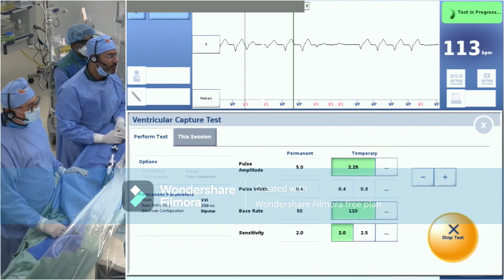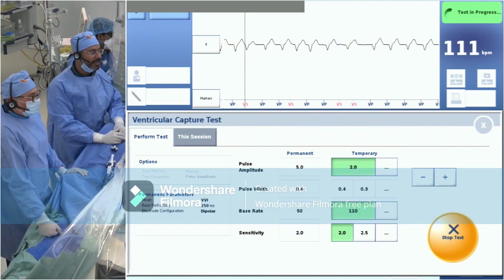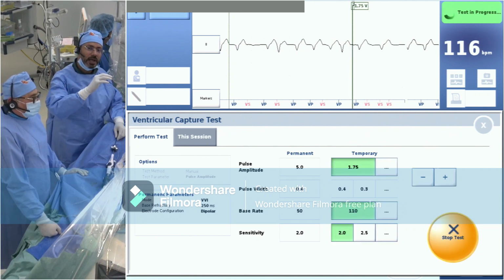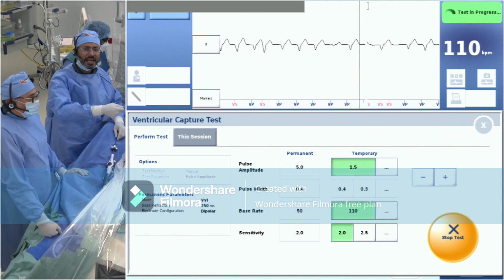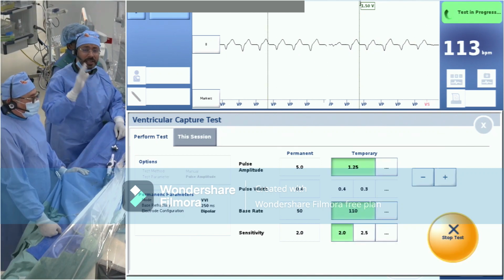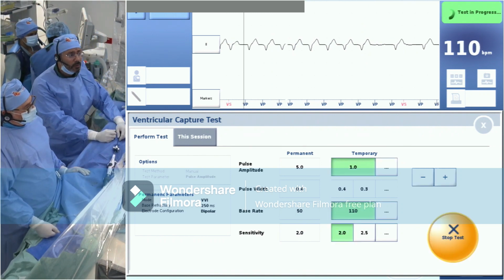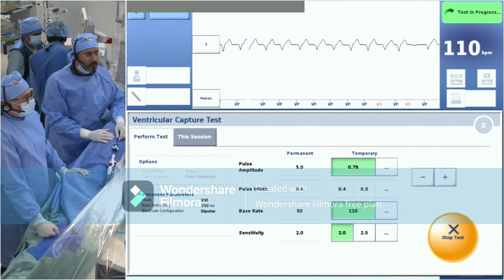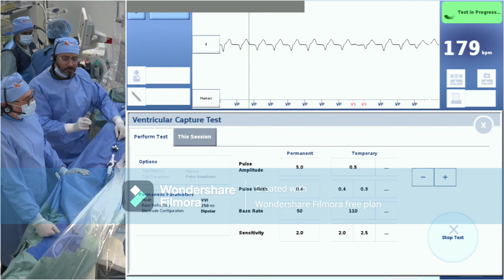Thank you. Two excellent questions. We had cases like this, to be honest. We had a patient who had a lead, she was dependent and she had malfunction, and the lead was in the low septum. So during that time we put a micro device in the mid to high septum, and we are planning to do extraction for her. This makes the extraction much better, having a backup pacemaker, especially placed mid to high septum, so it's away from our path for extracting the lead. And by the way, we have had 3 cases, because we have been doing leadless pacemaker since 2015 in patients with battery end of life, and we implanted 2 leadless pacemakers in the same patient.